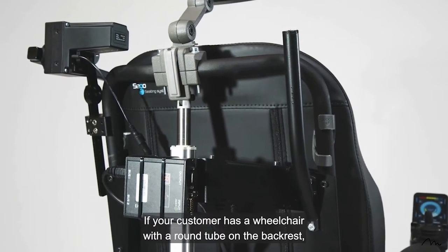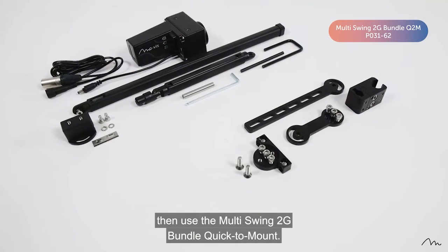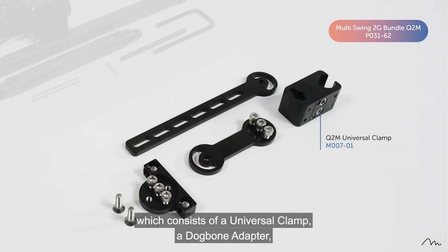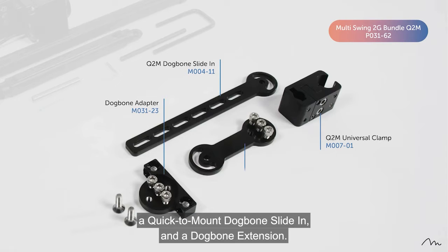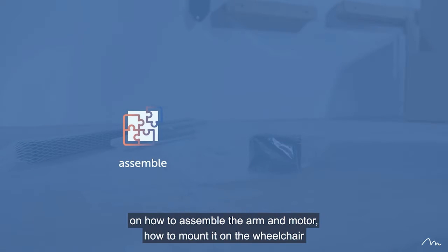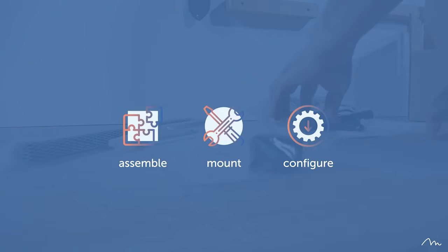If your customer has a wheelchair with a round tube on the backrest, then use the Multiswing 2G bundle quick to mount. In addition to the Multiswing, this bundle also includes the mounting set quick to mount, a mounting set which consists of a universal clamp, a dog bone adapter, a quick to mount dog bone slide-in, and a dog bone extension. In this video, you will get all the instructions on how to assemble the arm and motor, how to mount it on the wheelchair with the quick to mount mounting set, and how to configure the software.